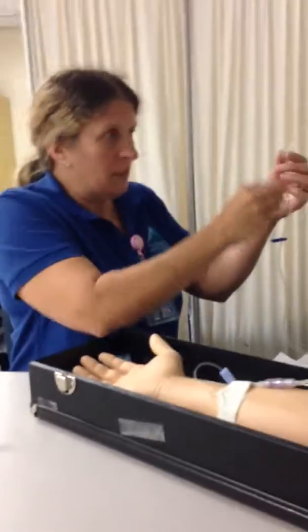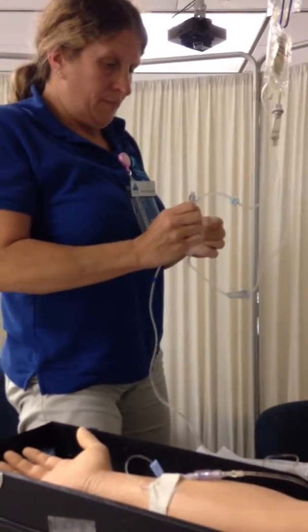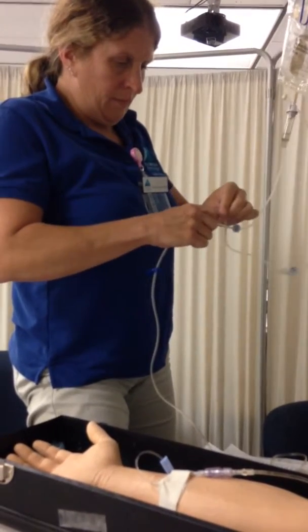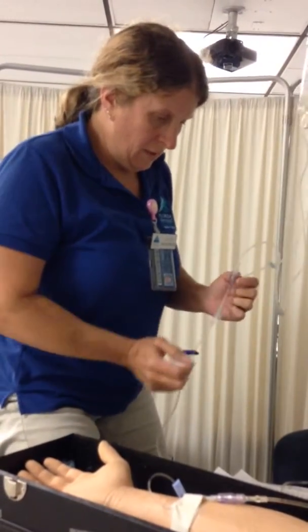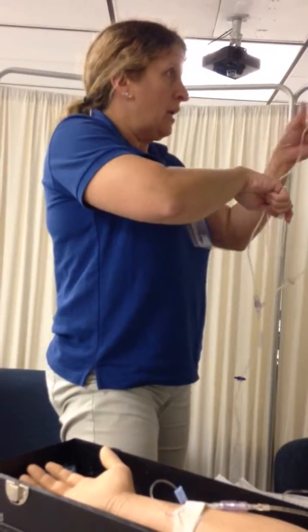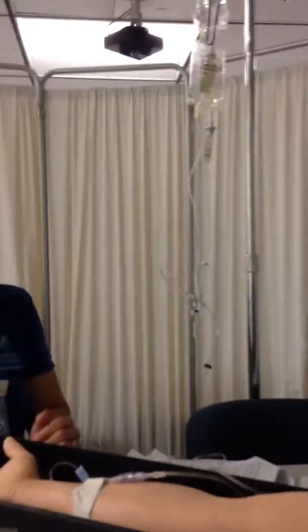And you didn't have to clamp it. Our clamps are below the port for a piggyback. Doesn't it say on there that you have to clamp it off? If this was above here, you would adjust the height by looking at your watch and you would put your piggyback in, and it drops, you would run it that way, ensuring that it's running at 17 drops per minute. If you clamp it, you clamp everything.